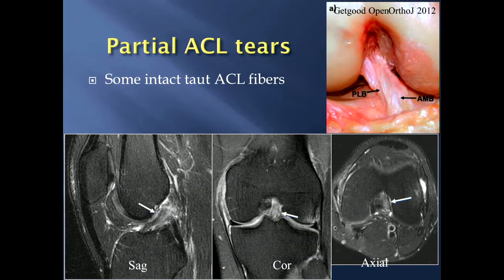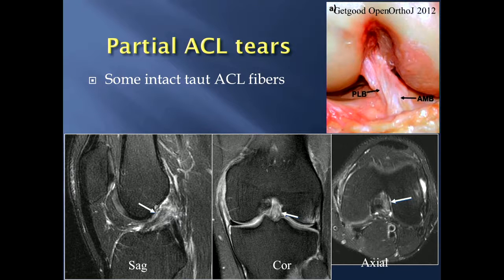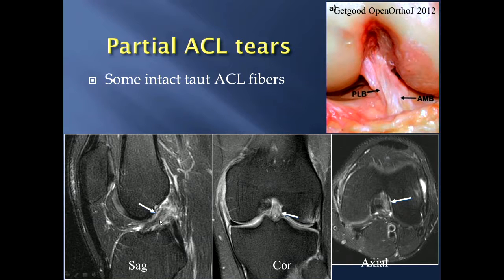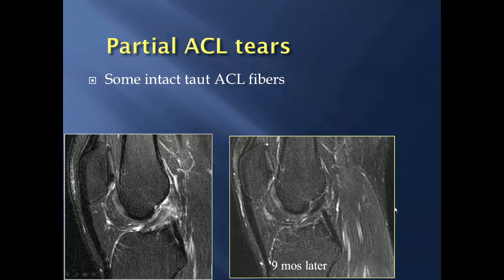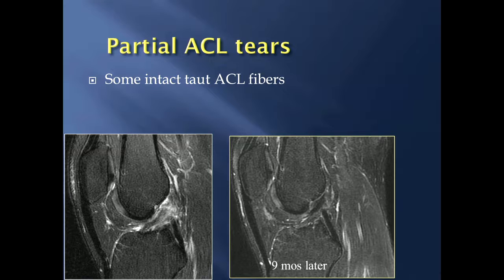Partial ACL tears imply that some intact fibers remain taut. These can be tricky, as their appearance sometimes overlaps with complete ACL tears. In one example, the ACL looked a little wavy with diffuse increased signal but no fluid gap — not a definitive sign. This same patient nine months later showed a healed ACL. Complete ACL tears do not heal, but partial tears, because some intact fibers act as scaffolding, can heal — as happened in this case.